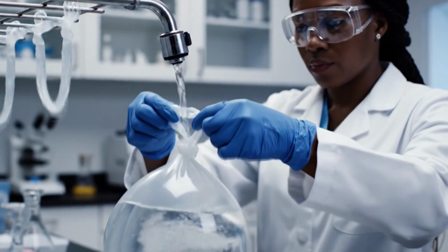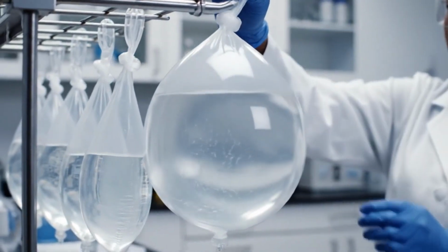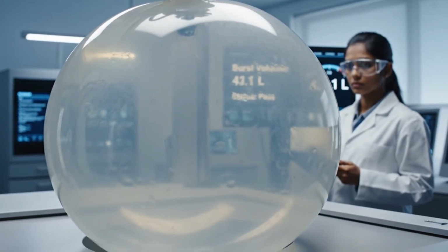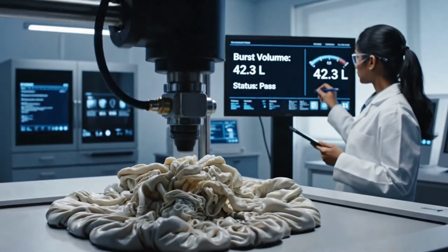We trust our machines, but we verify with our hands. The water leak test is the ultimate proof of integrity. A condom must be able to hold 18 liters of air before bursting. Our samples often exceed 40 liters.